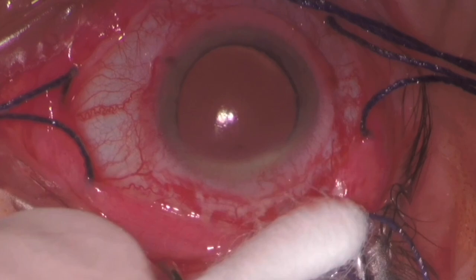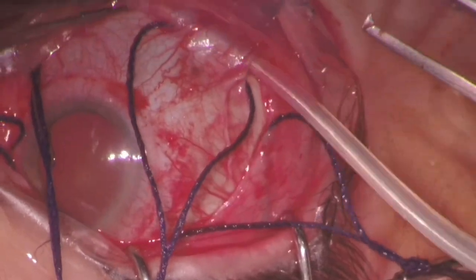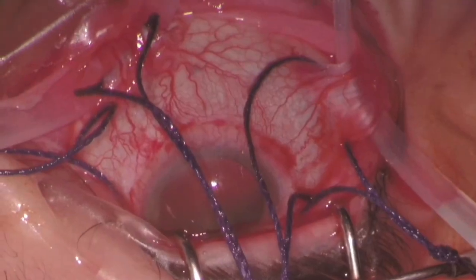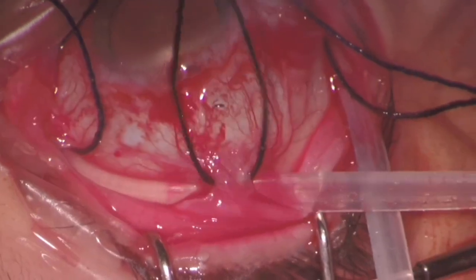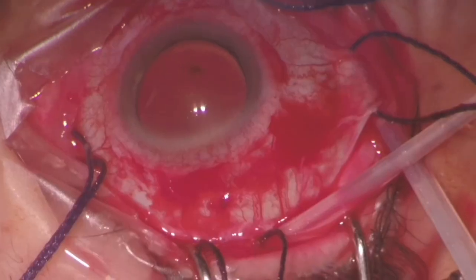To avoid excessive movement of the chandelier and risk of touching the lens, after cryopexy it was removed. Subsequently, the buckle was passed under the rectus muscles, and to reduce the risk of vitreous prolapse, the sclerotomy was sutured.